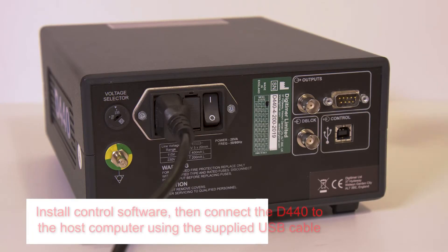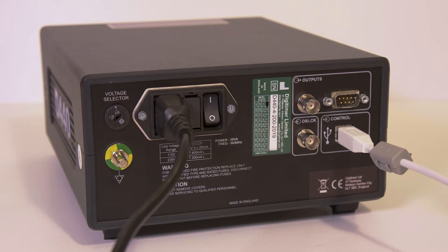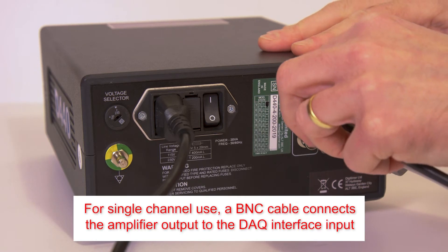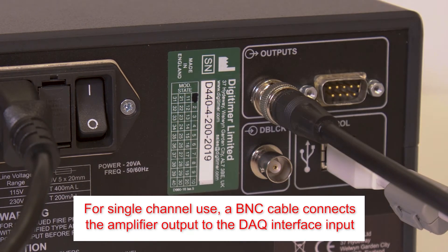Connect the supplied USB cable to the host computer, having already installed the D440 control software. For applications that only require use of Channel 1, a single BNC cable should be connected between the Channel 1 signal output socket and the input of the data acquisition device.